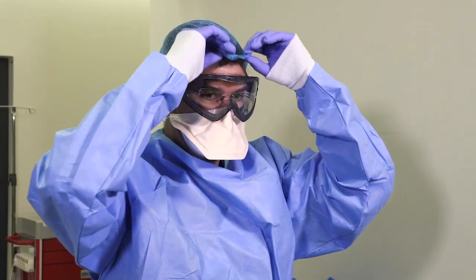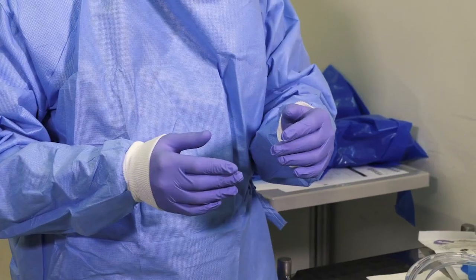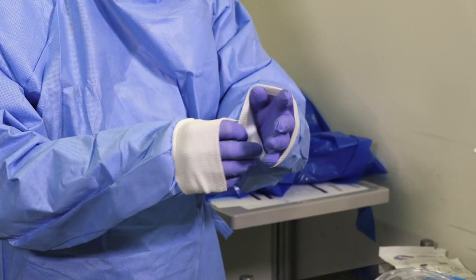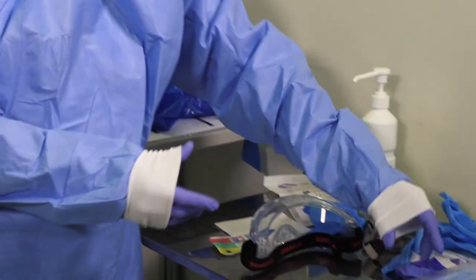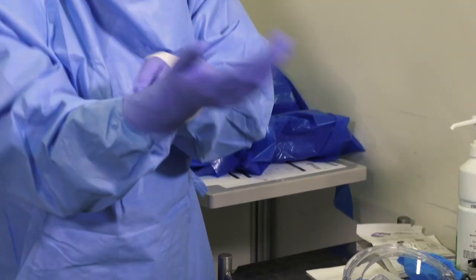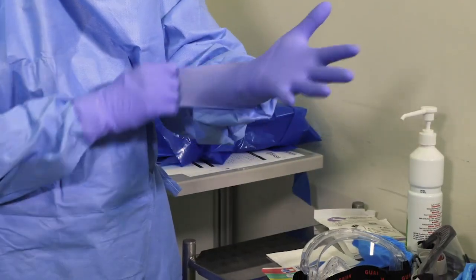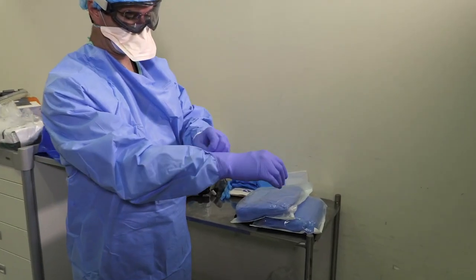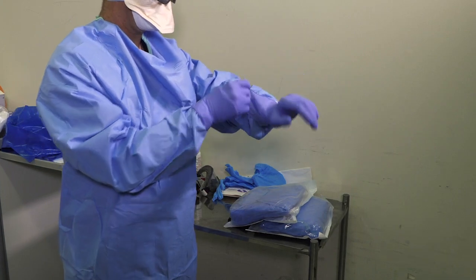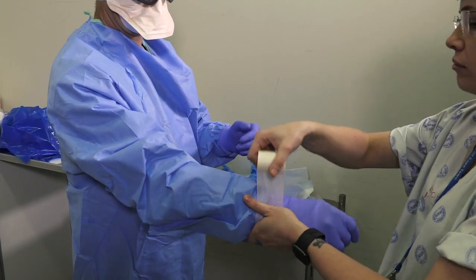Your disposable cap has moved backwards — please cover your hair again. Next is outer gloves. Pull the sleeves of your gown down over your knuckles so that when you put your gloves on, they cover the cuff. We tape the gloves to the sleeves of the gown to make sure they come off when you remove the gown in one piece. Don't put the tape circumferentially, otherwise you might block blood supply to the hands.